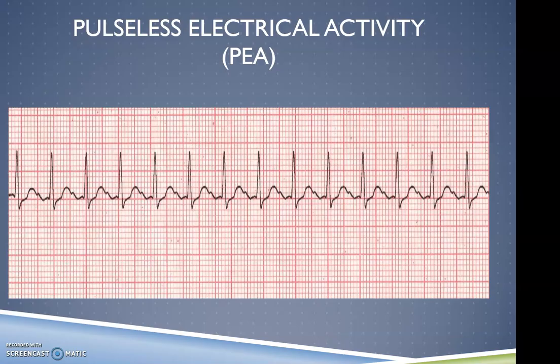So this is why you need to check on your patients, and you can't solely rely on monitor techs. You could monitor a patient that had a rhythm all night looking all nice and neat like this, and they could be dead. So you have to check on your patients. Relying on a monitor tech is not a prudent thing to do. They are not physically able to go into the room and check on the patient. From their viewpoint, it looks fine.